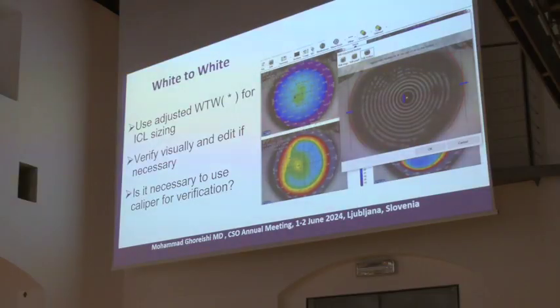For the white-to-white measurements, as I have mentioned, use the adjusted white-to-white instead of the usual white-to-white. You can verify the white-to-white visually if you look at it.